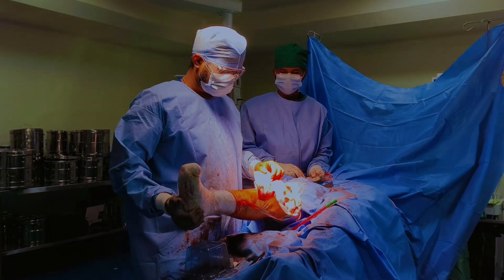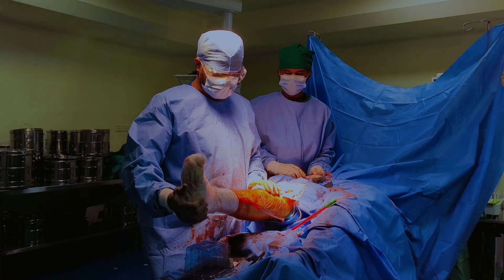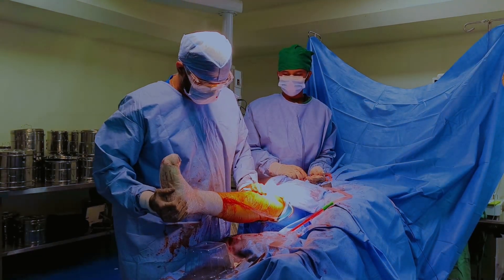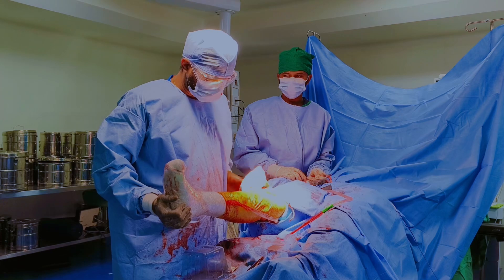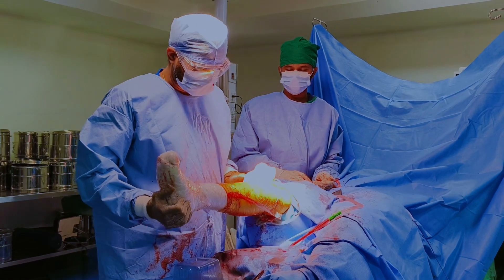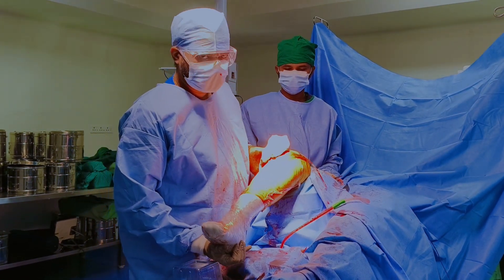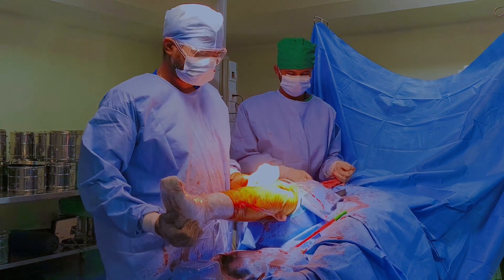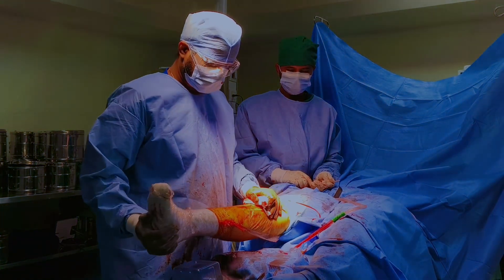We have corrected the recurvatum deformity. Now the extension is neutral, and flexion has been achieved up to 90 degrees. Now it is a stable movement.